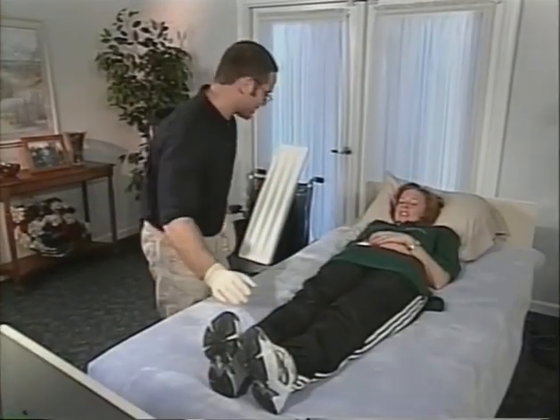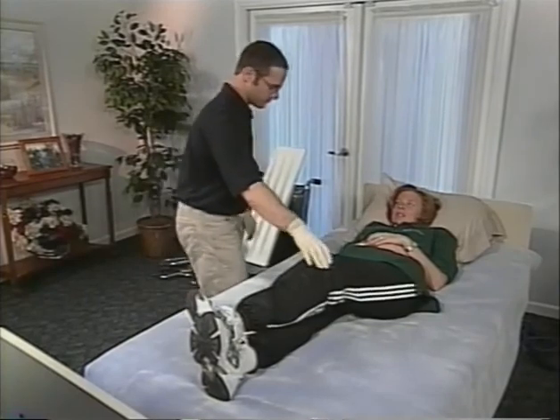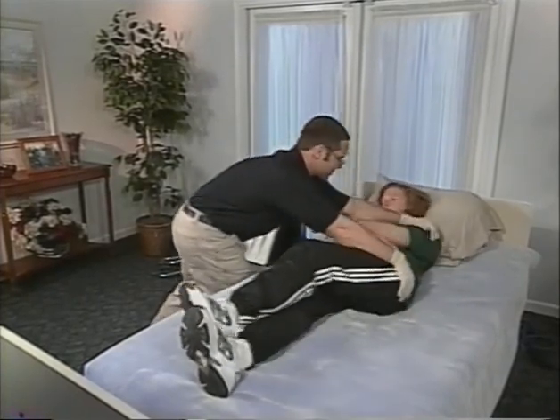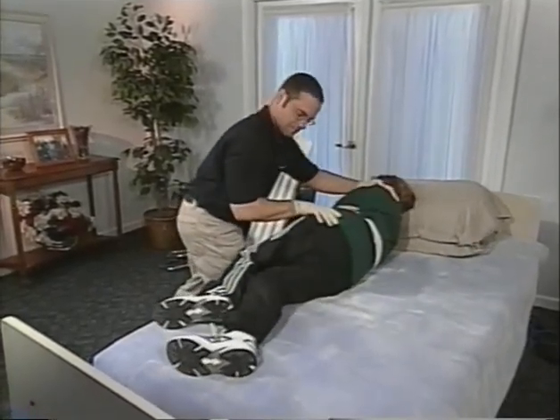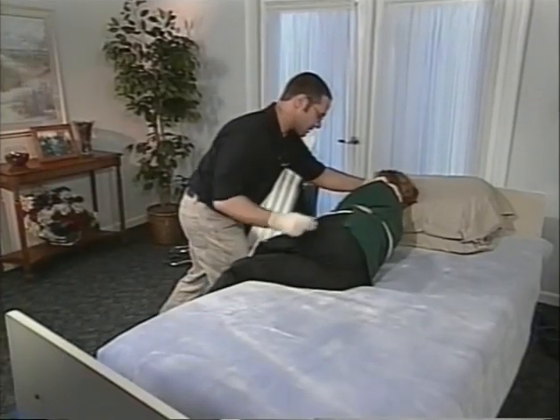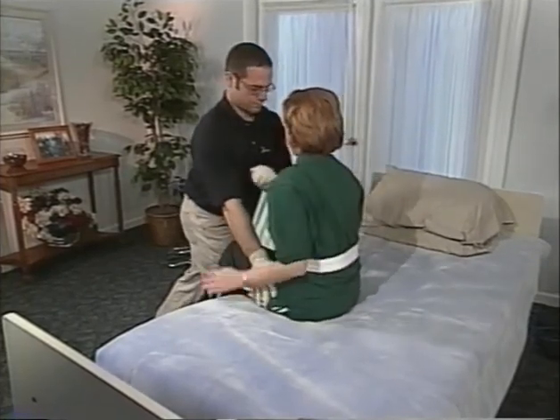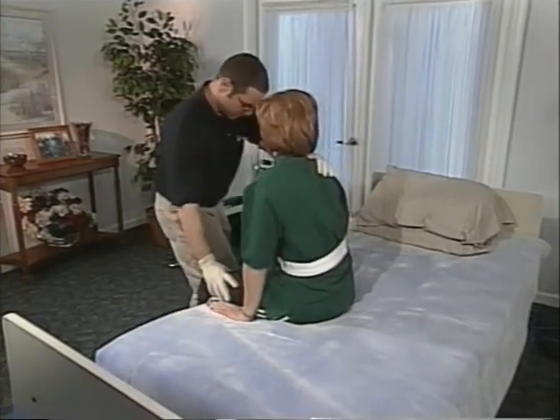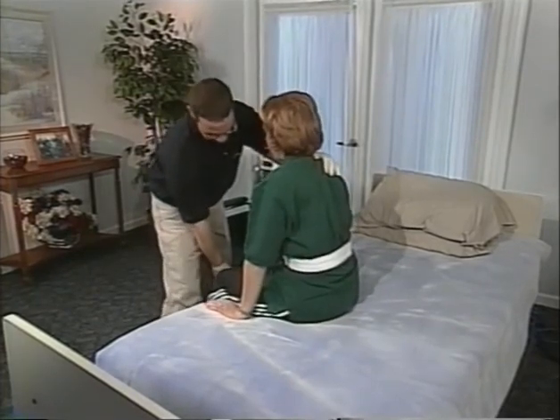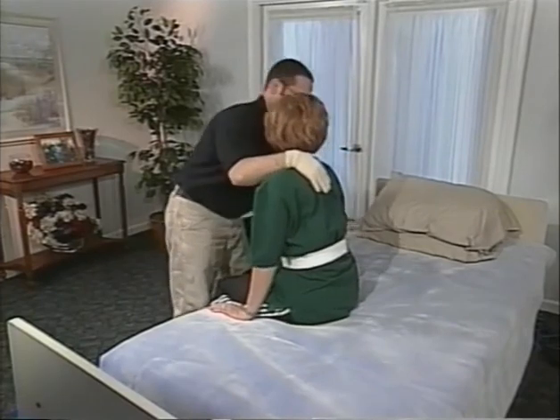Sliding board transfers are very similar to squat pivot transfers. They work especially well for obese individuals, clients who are non-weight bearing in their legs, or clients just learning to participate with their transfers. Repeat the previous procedures for wheelchair and client preparation. Once the client is sitting at the edge of the bed, elevate the bed slightly higher than the wheelchair to allow gravity to assist you in the transfer.